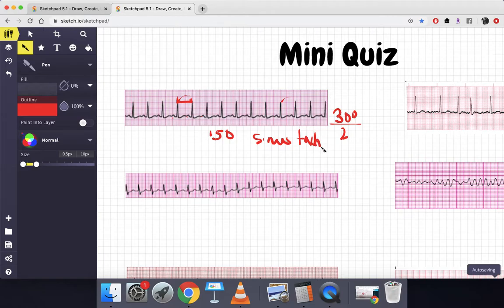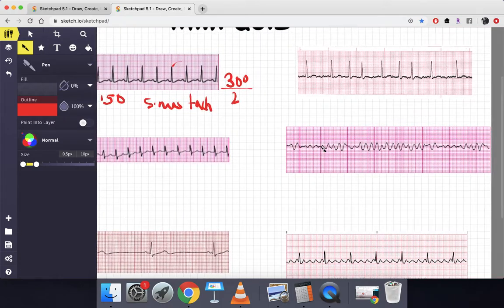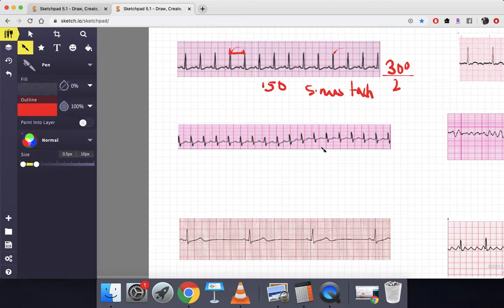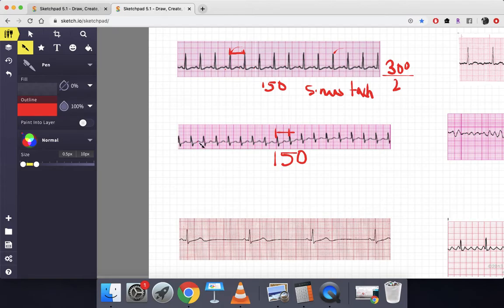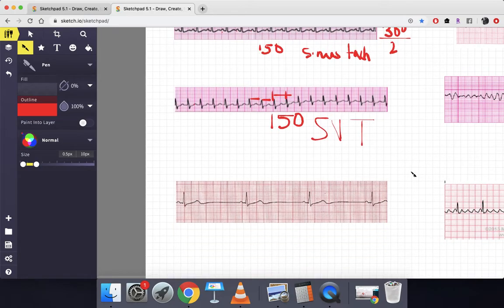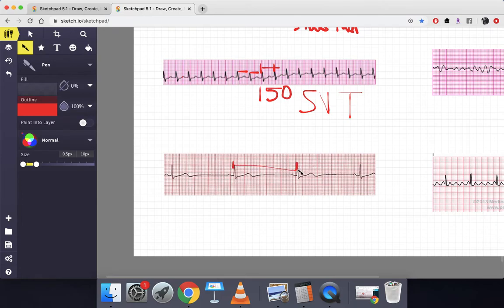Please pause the video to answer on your own. Next one: between the R intervals is two big boxes, so 300 divided by 2 is 150 — tachycardia. Are there any P waves? There seems to be a wave here, but if this is a P wave, this can't be the T wave for the previous complex, and if this is the T wave, there's no P wave for that complex. So when we have tachycardia, no clear P waves, and regular R intervals, this is supraventricular tachycardia.